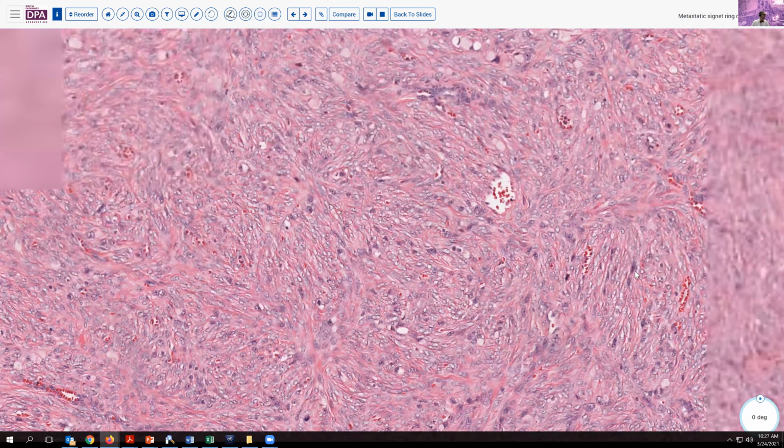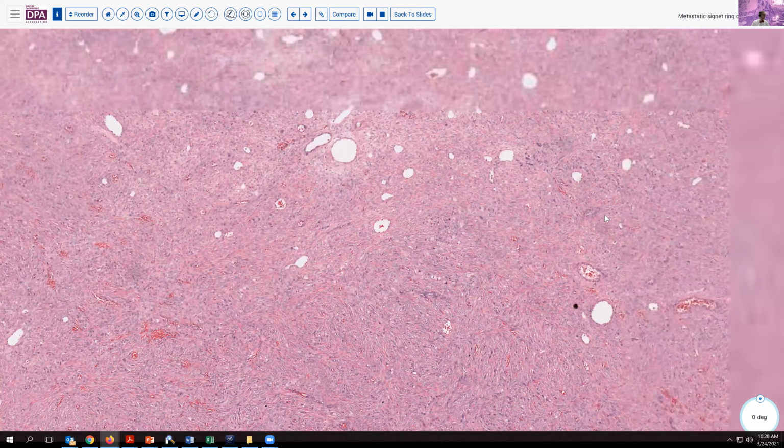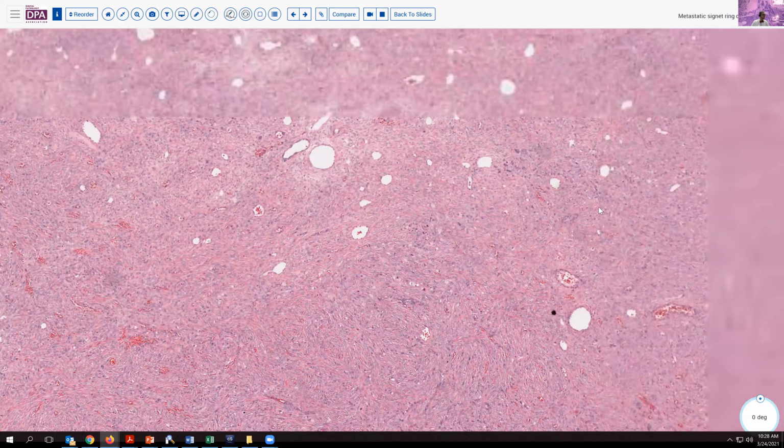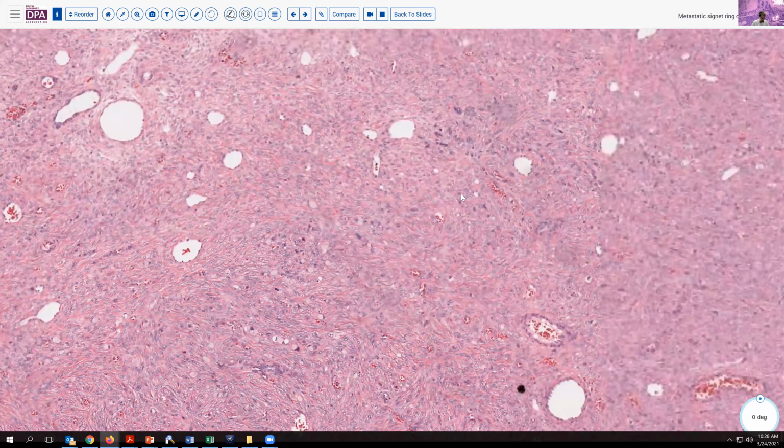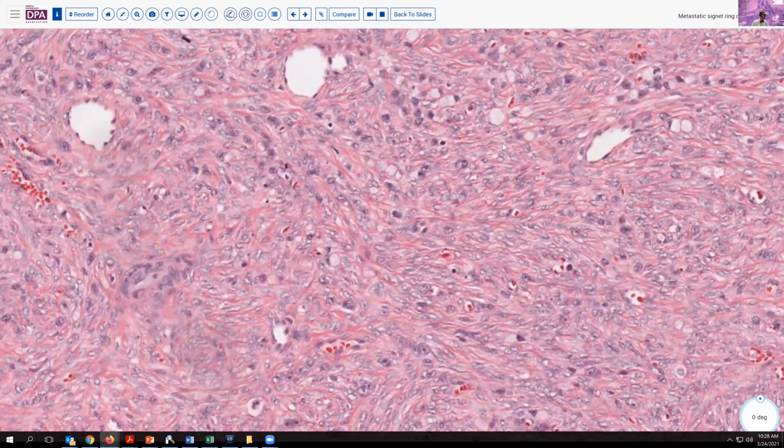So this fibroma-like pattern can be repeated in a number of circumstances, but is probably most frequently seen in disseminated signet ring cell carcinomas that can be so difficult to detect intraperitoneally, even in the primary location, because they don't tend to form a discrete mass, but instead present with a linitis plastica appearance or an infiltrative pseudo-inflammatory type pattern.